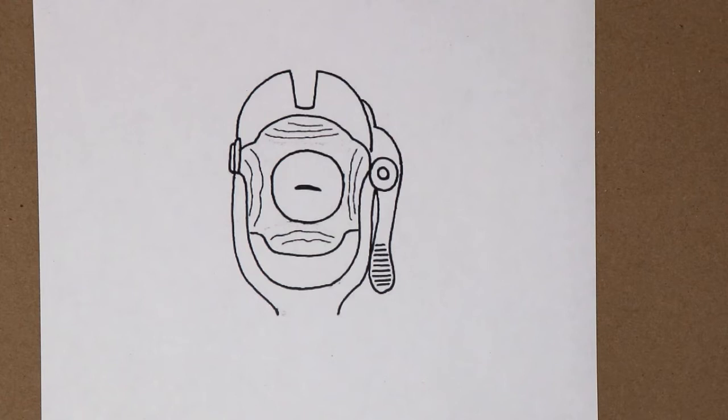This diagram is a pictorial representation of the vagina with the speculum inserted. We can see the cervix, and below the cervix, the fornix. A speculum should always be used where possible, but should not be lubricated. The speculum can be warmed with warm water or a gloved hand. The use of a speculum allows better visualization of any injuries that may be present.